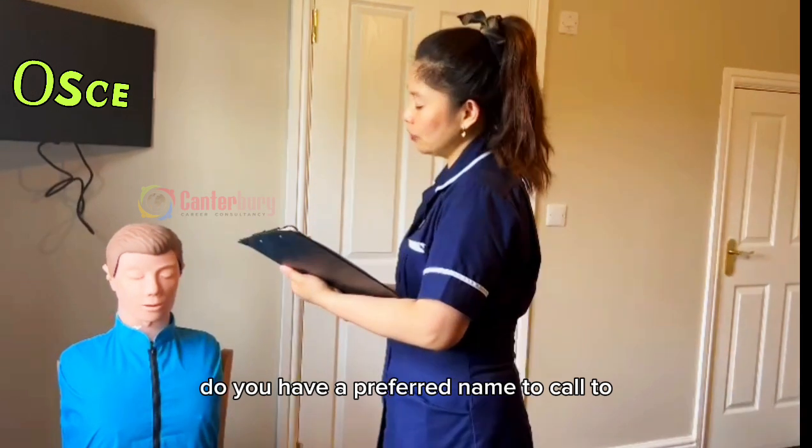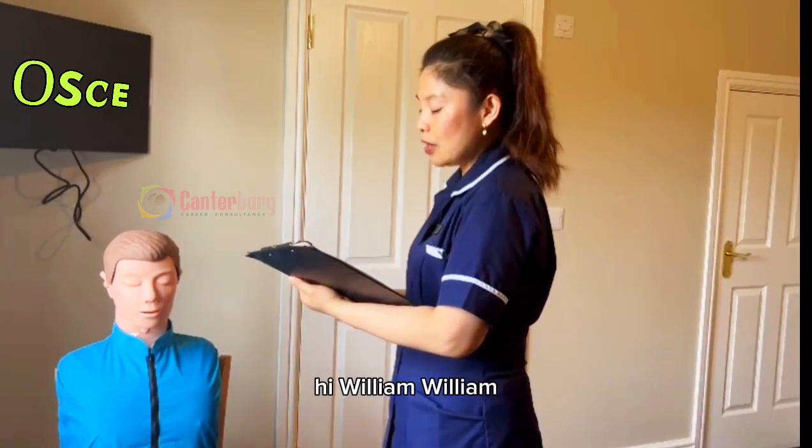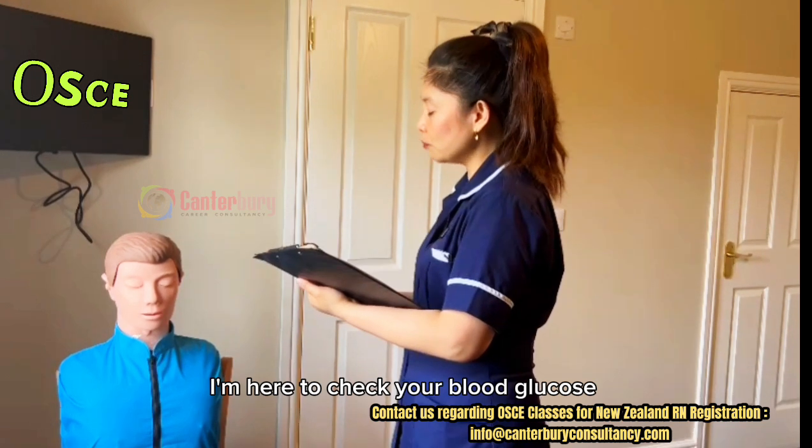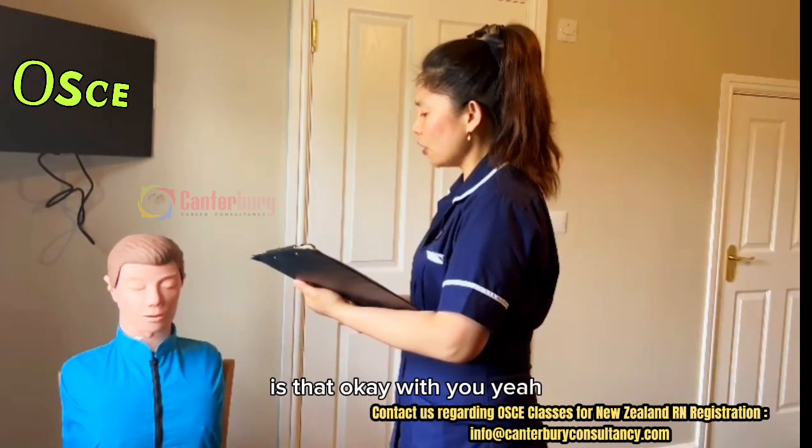I'm good, thank you. Do you have a preferred name to call you? Yeah, you can call me William. Hi, William. I'm here to check your blood glucose level — your blood glucose reading. Is that okay with you?